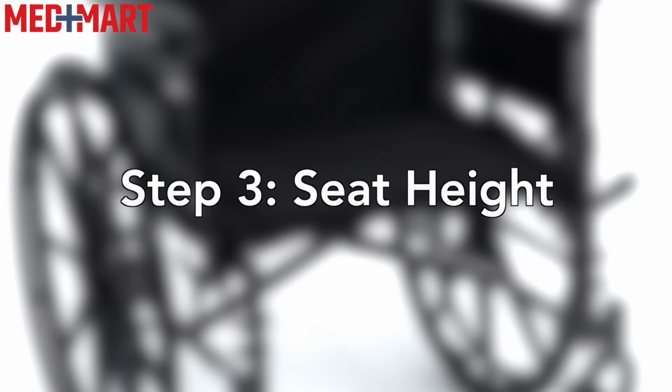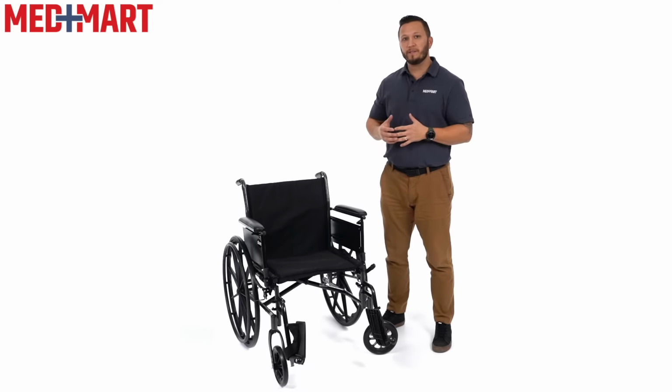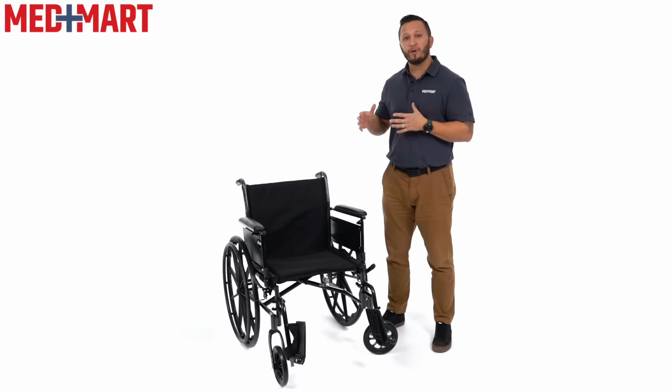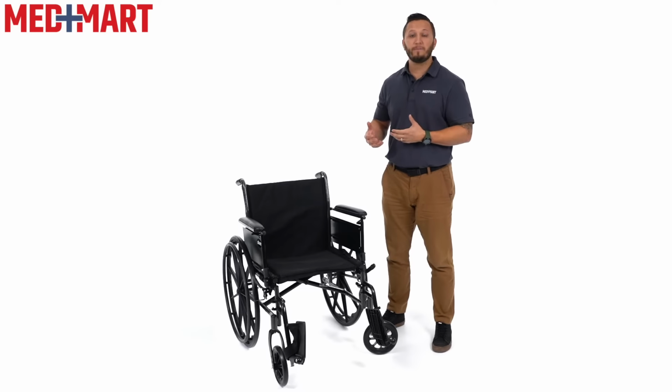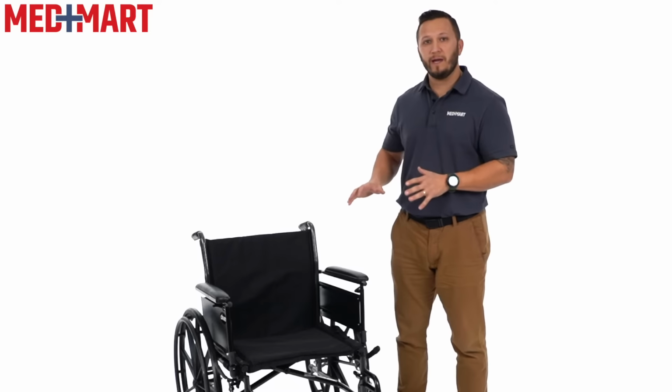It is also important to consider seat height when it comes to purchasing and modifying a standard manual wheelchair. The reason being is because if somebody does want to have their feet on the ground to help propel themselves forward, they can't have the wheelchair too high where their feet are dangling. Likewise, if the patient is transferring and has a hard time going from a seated to a standing position, if the wheelchair is too low, they're going to have a more difficult time standing up to get out of the wheelchair. There's a couple different ways that you can modify the seat height.